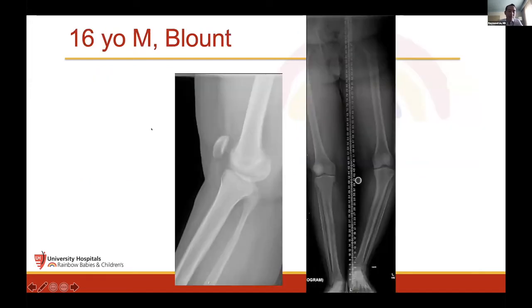This is a patient with Blount disease, and classically Blount has always been treated with hexapod external fixation for most people in today's day and age, and that's still my go-to treatment. But on occasion, I feel like there's certain patients that just can't tolerate it, and if they do not have procurvatum, like this patient has no procurvatum on that sagittal view, and if their osteotomy site, where you think their deformity is, is reasonably distal, then you have the option of a nail. It's really challenging, but you can do it.